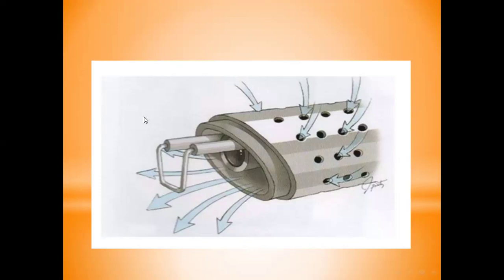If you have a bloody picture because of bleeding, you can open this channel to drain the fluid and insert a new fluid. A good distension decreases the amount of bleeding. If you have no good distension, the bleeding is increased, because distension is important not only for visualization but also to decrease the amount of blood so you can see the picture obviously.